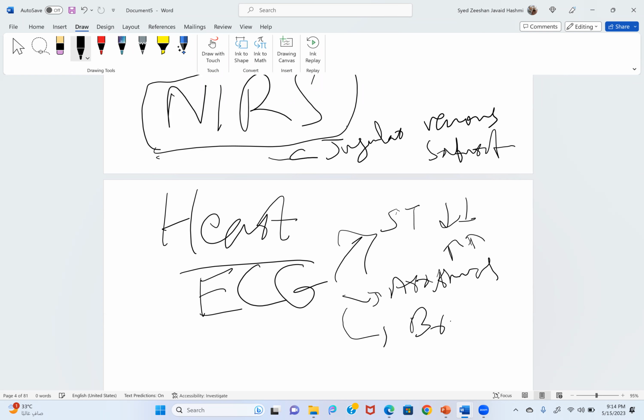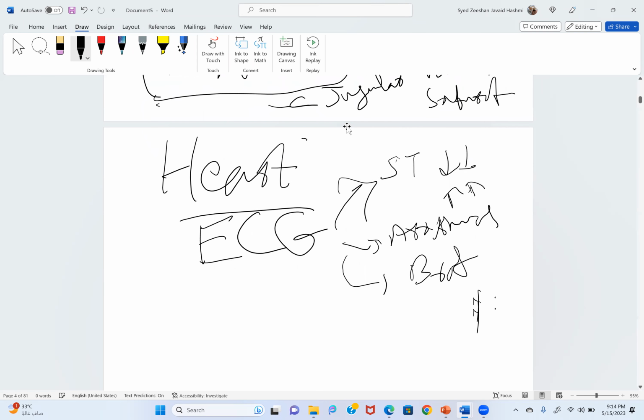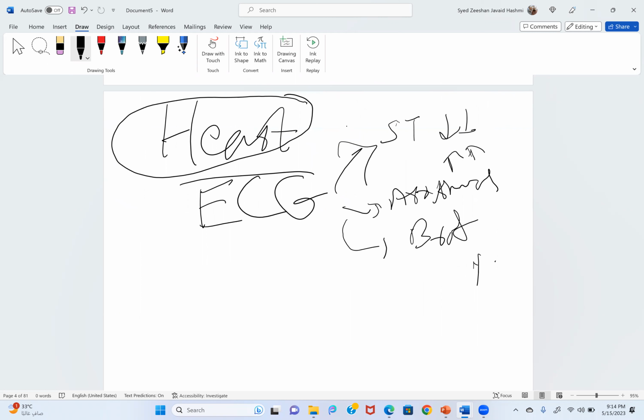especially if it is related to the conducting system of the heart, there may be bradyarrhythmias. Okay, so this concept is not written as such, but I'm just giving you a concept of how to monitor the vital organs, because this is how you should be knowing about your vital organs. Okay, so this is actually the same thing but with a different mindset. So ECG will tell you a lot of things. Okay, then what else other than ECG?